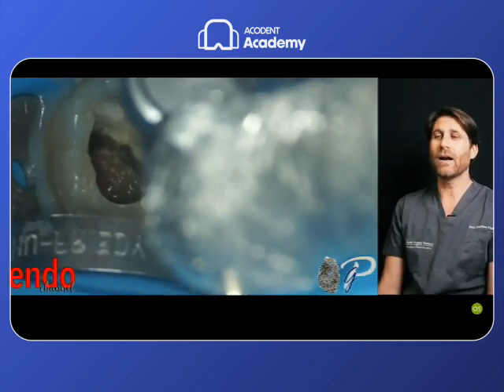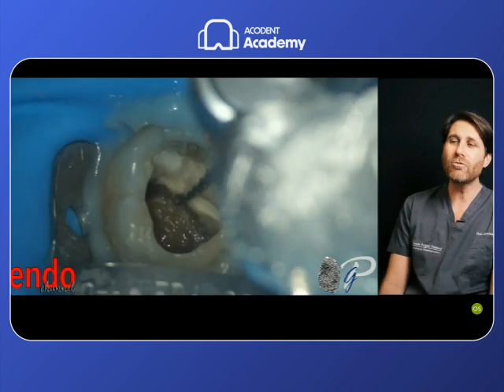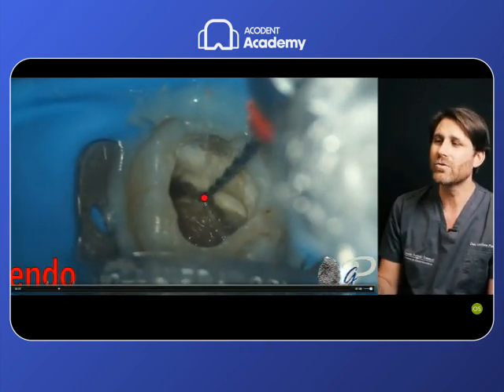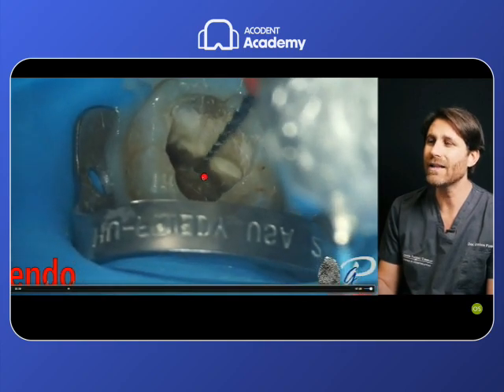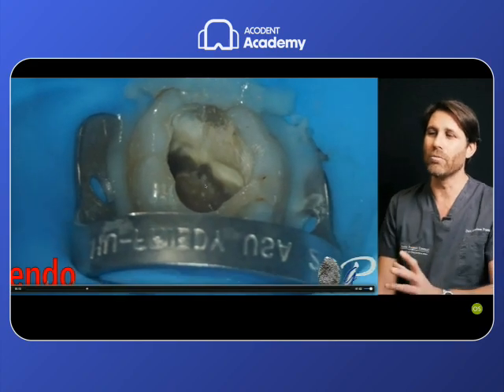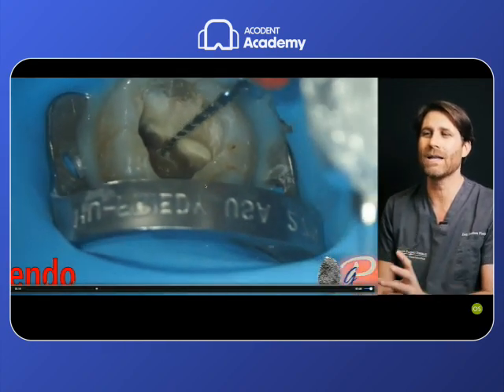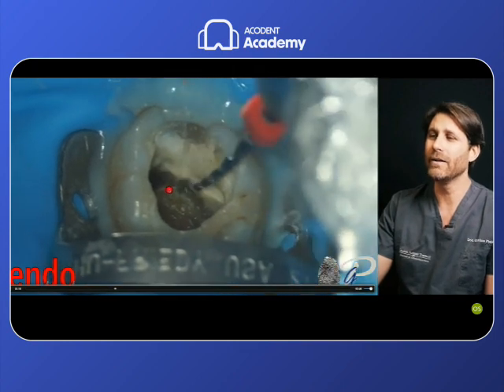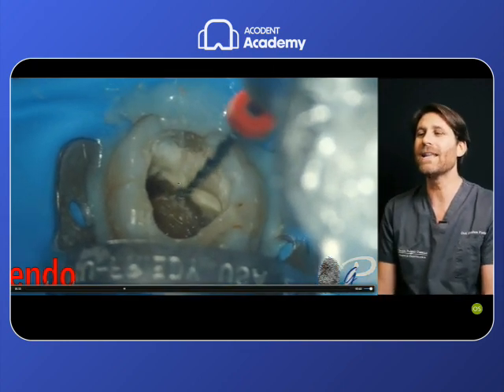And this is a clear explicative video of an unscoutable MB2 root canal after the orifice location. As soon as we find the orifice and we find the invitation, I use the tip of this file as a probe, as a mechanical probe, a probe in mechanical movement. This is like a probe. I go in the invitation of the orifice, and then I start the movement.